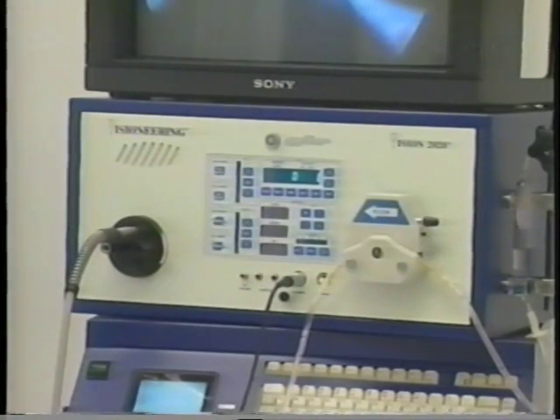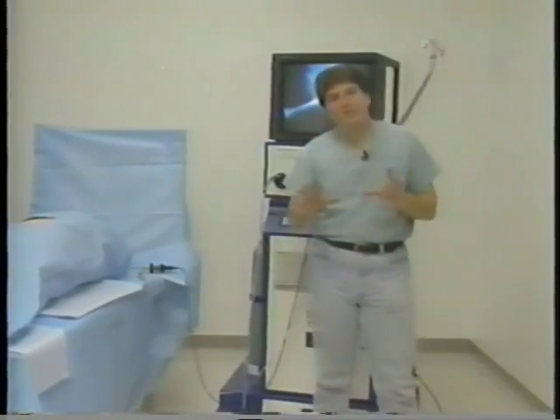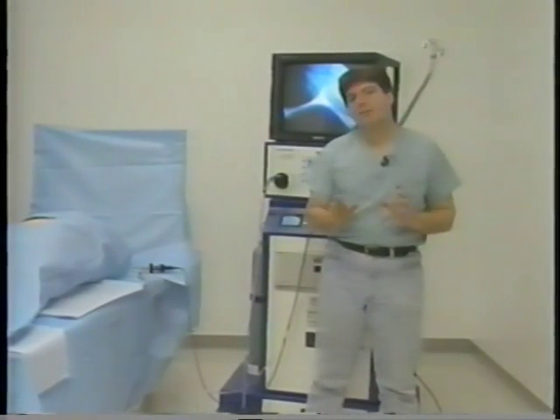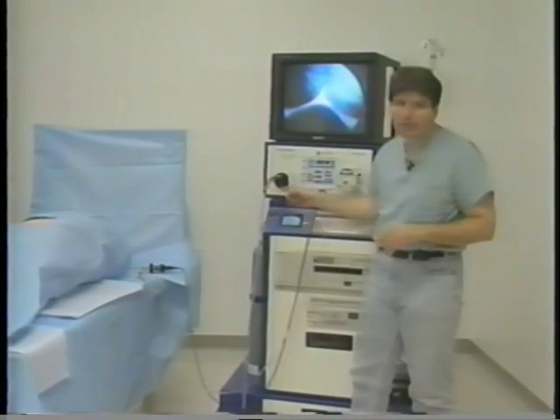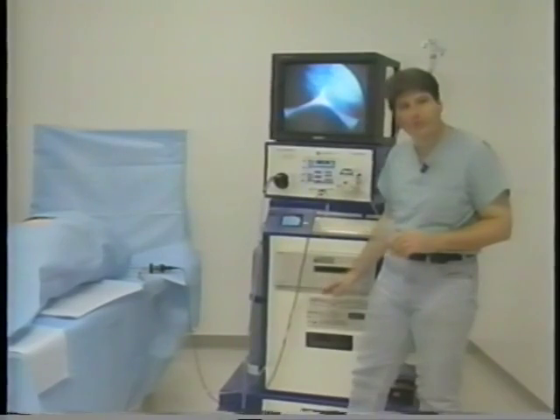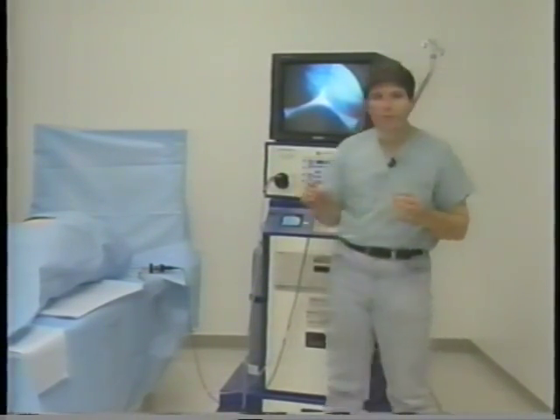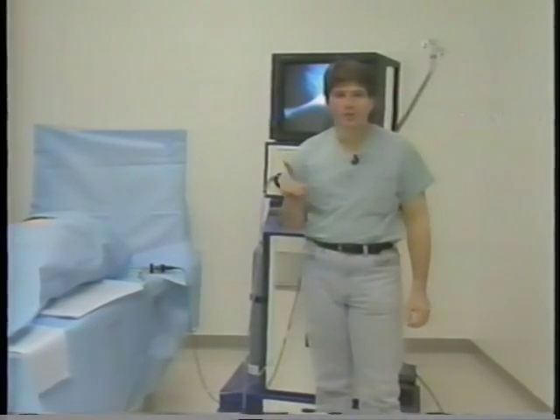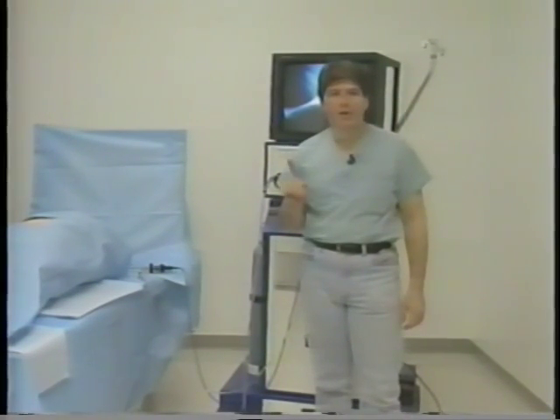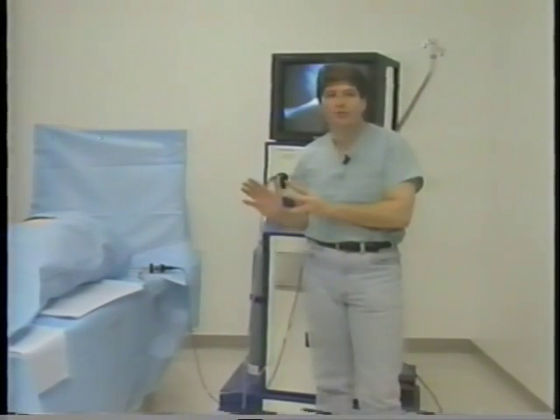The most important feature is this: the entire unit is controlled by the push of one button. This single power switch activates the light source, the camera, the irrigation system, the insufflator, the video printer, the video disc, even the off-the-shelf style components built into our system — all run off of one power switch and connected with one power cable. There are no wires and cables in the back, which we will demonstrate in this video.